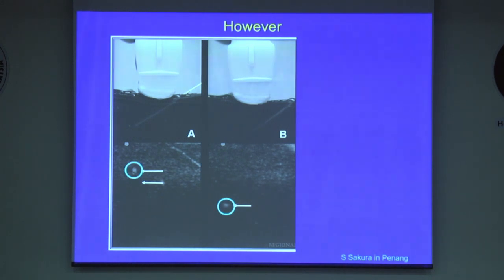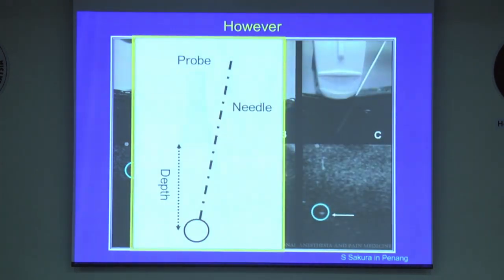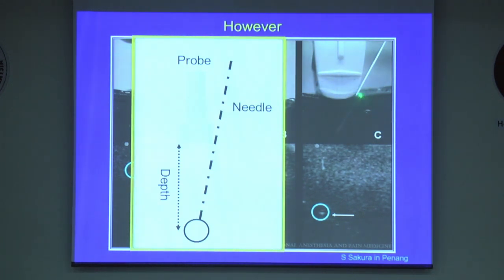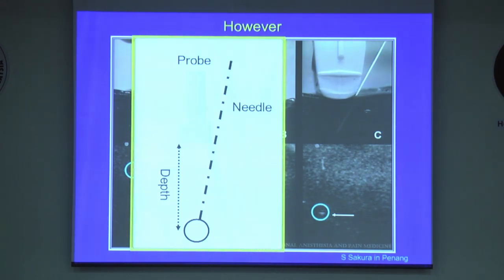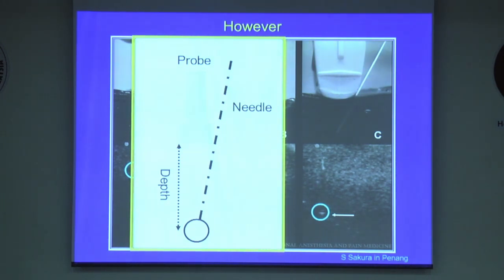So instead, I recommend that you insert a needle at a steeper angle and closer to the transducer. That way you can reduce the length of needle shaft that can be imaged and make the error less likely.